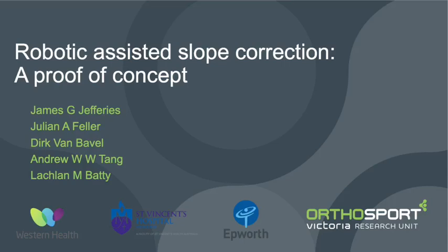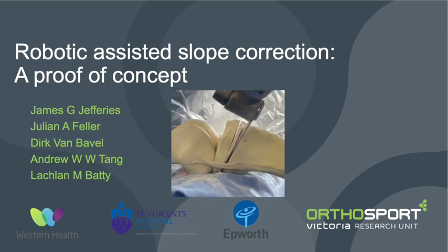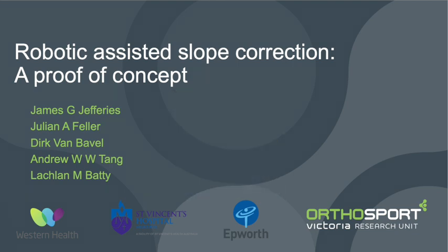In this video, we demonstrate a technique using a Mako robotic system to perform bone cuts for an anterior closing wedge osteotomy of the proximal tibia.